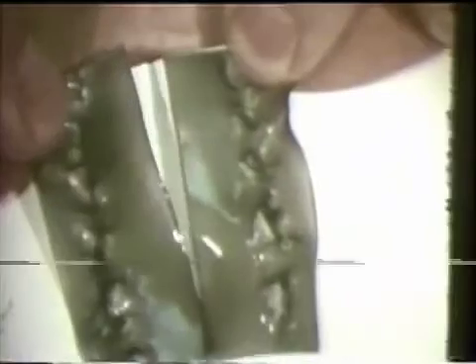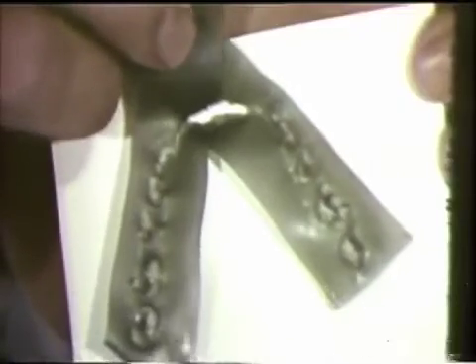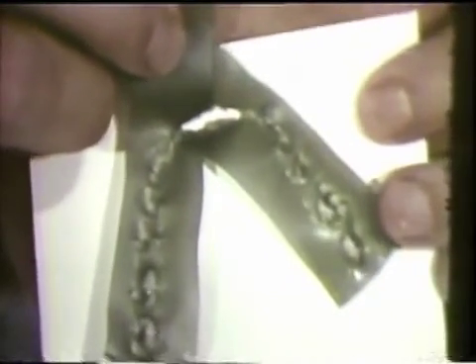The left retrusive lateral excursion is tested in a similar manner. Again, notice the even contact patterns in the wax with no perforations on the balancing side. Wax is now placed over all of the teeth and the patient is instructed to perform protrusive movements. The anterior teeth penetrate the wax evenly with no penetration posteriorly, meaning we have a satisfactory incisal guidance.